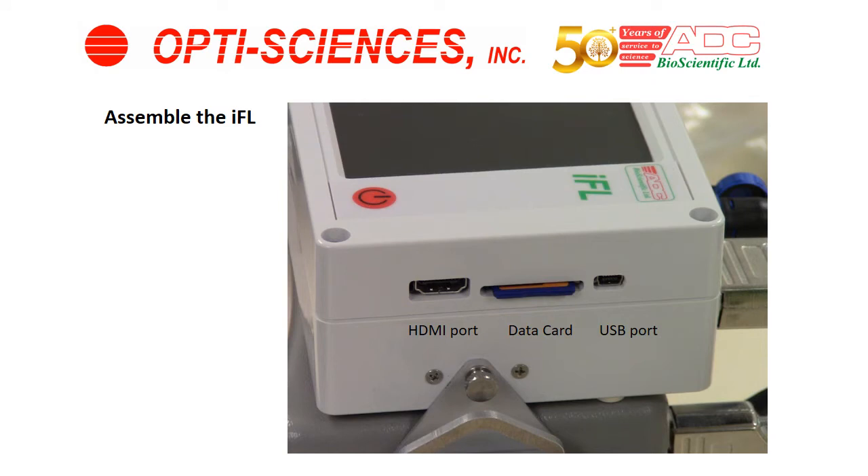The IFL comes with two data cards. Take one data card and put it inside the IFL console as shown. You can also hook up an HDMI port to display the screen on a television. The USB port is there for transferring information, but currently the data card is the best way to transfer data from the IFL to your computer. An adapter in the IFL box lets you insert the data card, and the adapter end has a USB port for connecting to your computer.